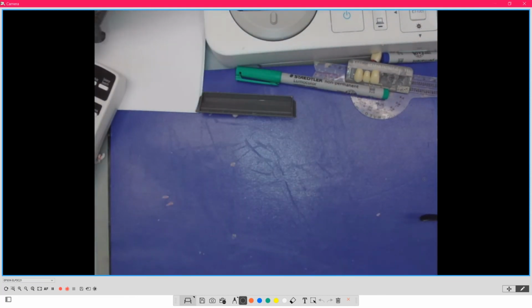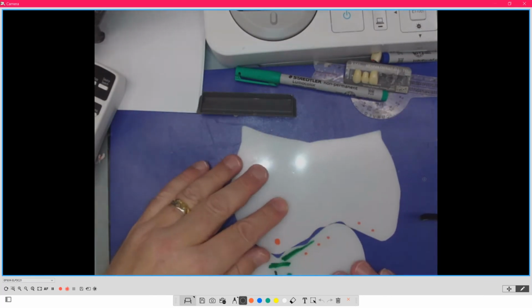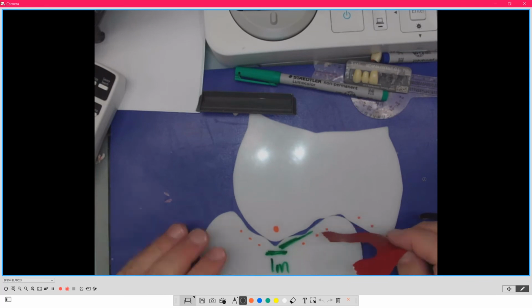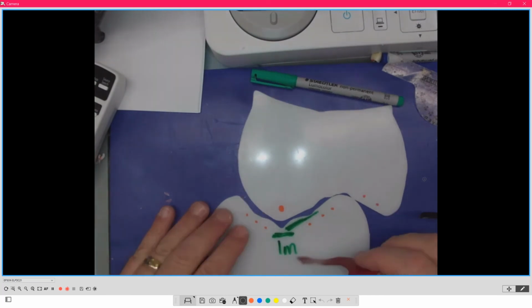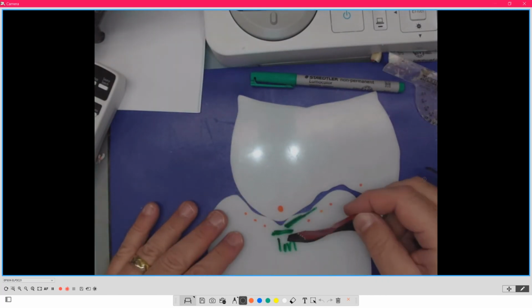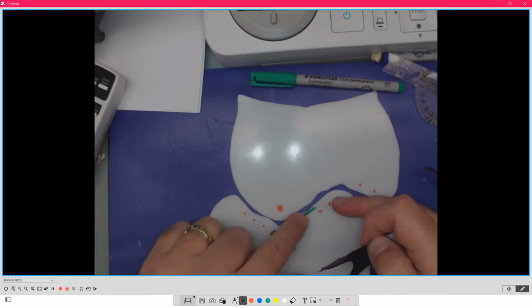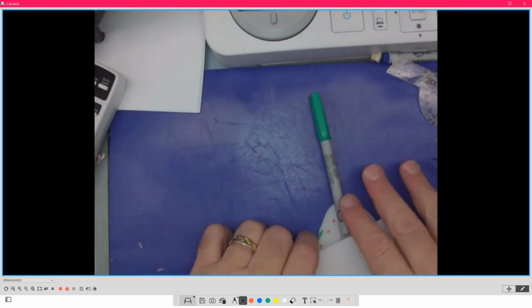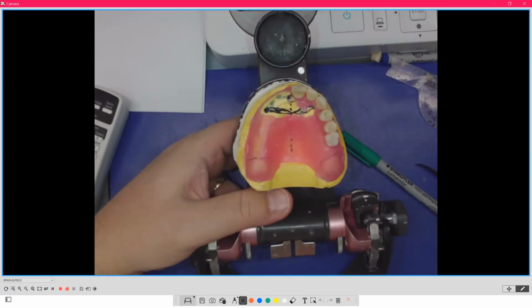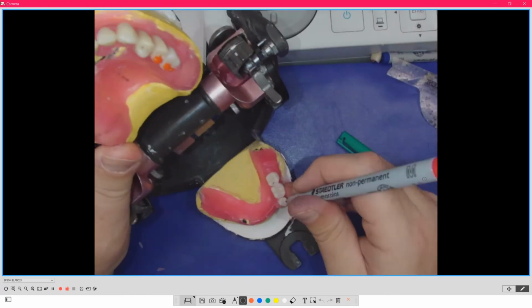So what happens is when you have this, and now when I stick paper between that, and I bite, the paper is going to bend and mark itself, and you do get erroneous readings. When you follow what I'm going to show you now from a calibration perspective, you do not get the erroneous readings. So remember, you're going to color the main cutter cusps, whichever ones you really ended up using.